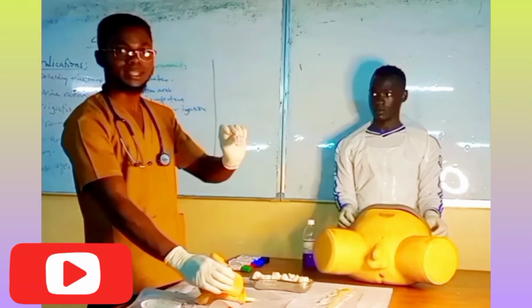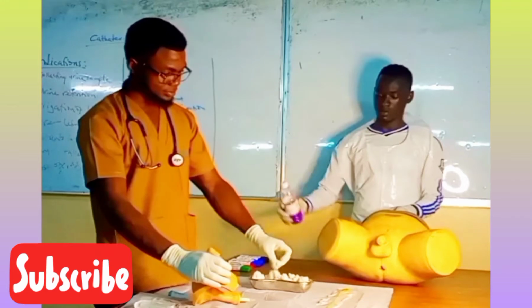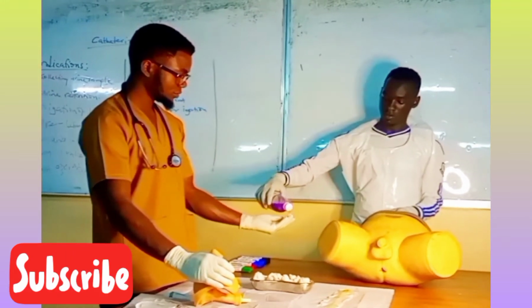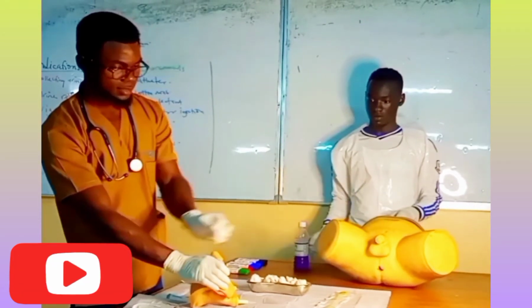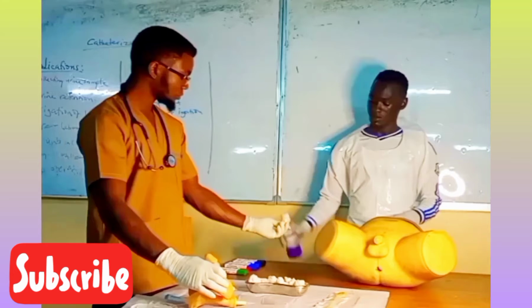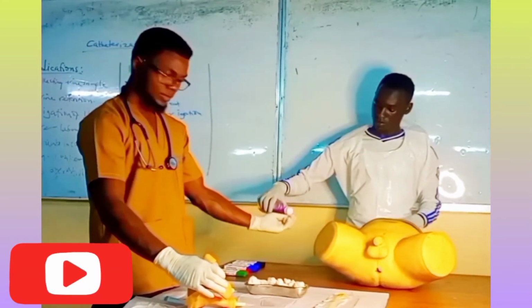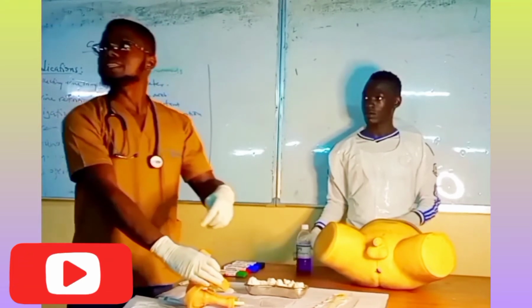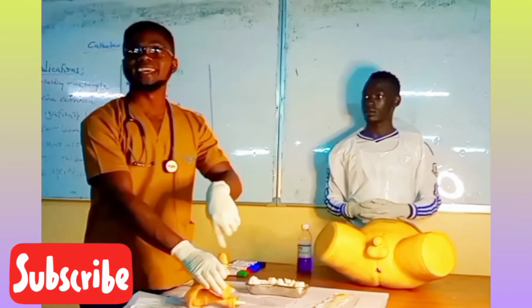So I hold like this, then I clean the nozzle part first. I pass it once, then I discard it. I get the next one, pass once, and discard. Are we together? Yes. Get another one. I start to disinfect from the glans penis, the head.